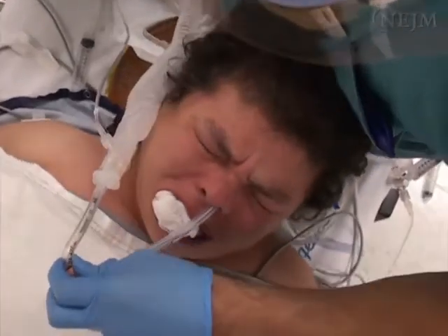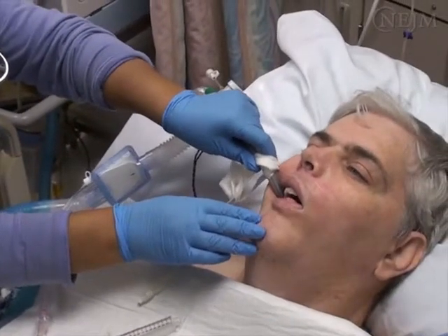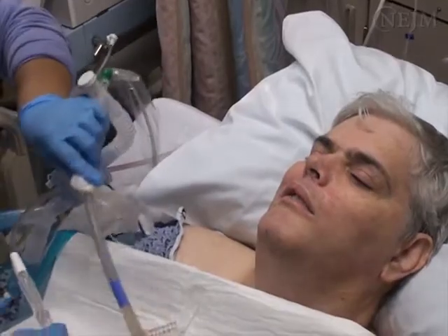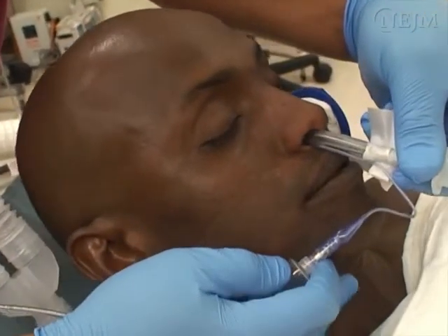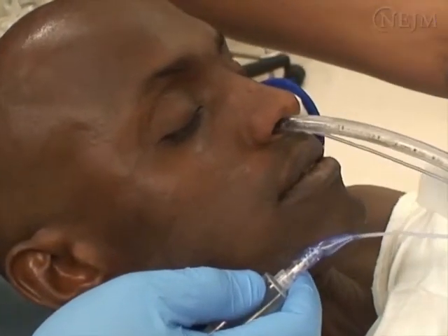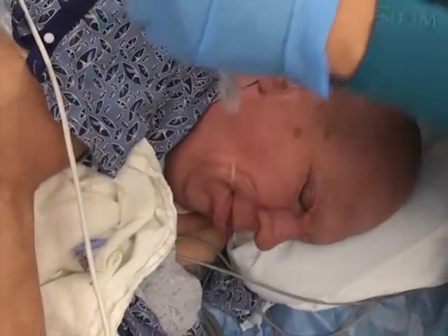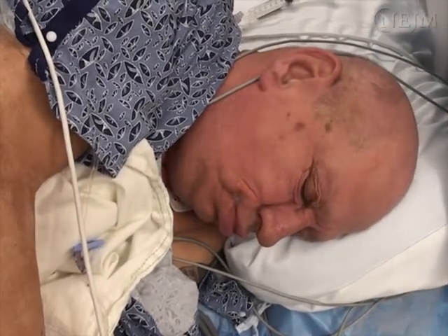Before performing extubation, the clinician must carefully prepare the medical resources needed to address foreseeable complications. A failed extubation can lead to a precipitous deterioration in the patient's condition, and attempts to improvise solutions under these challenging circumstances are rarely satisfactory.